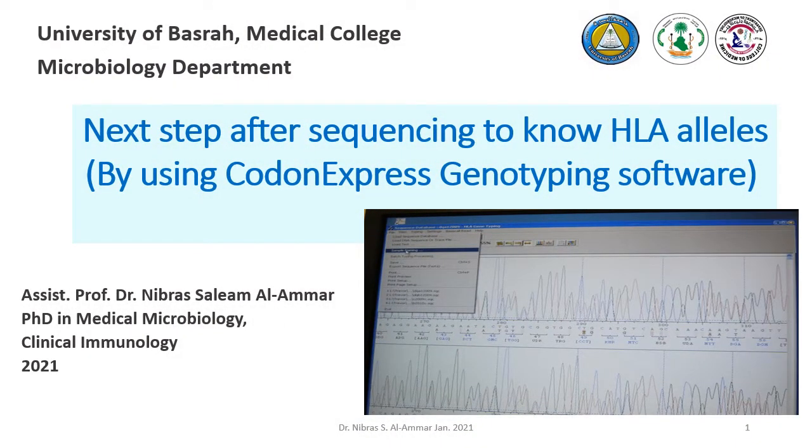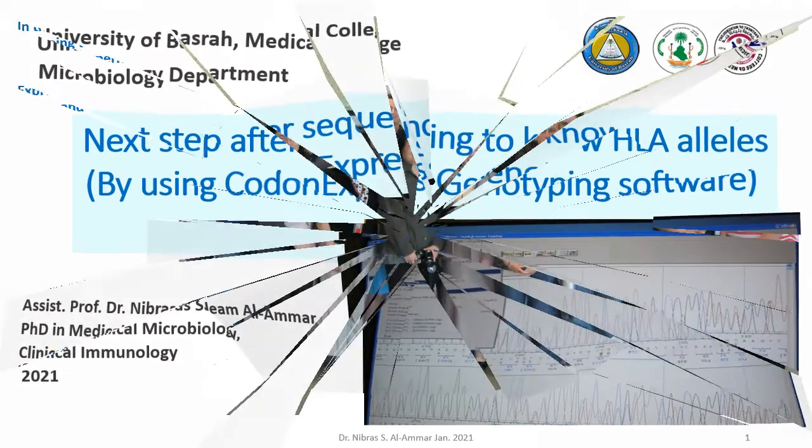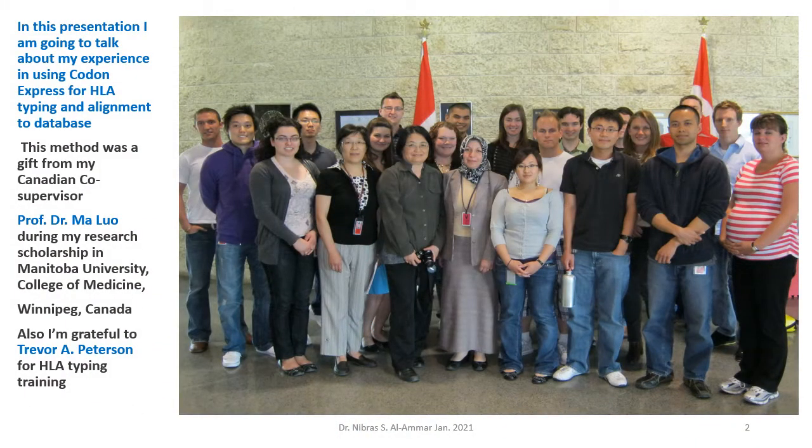Our lecture for today is about the next step after sequencing to know HLA alleles by using Codon Express genotyping software. In this presentation, I am going to talk about my experience in using Codon Express for HLA typing and alignment to database.